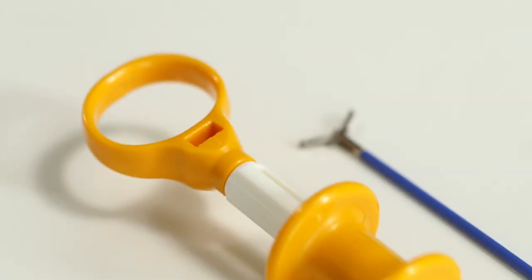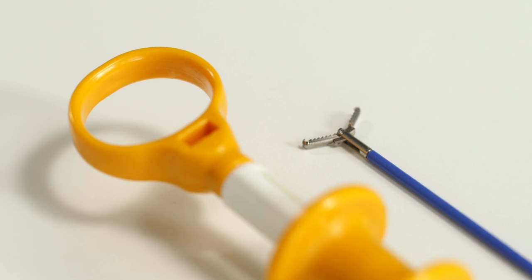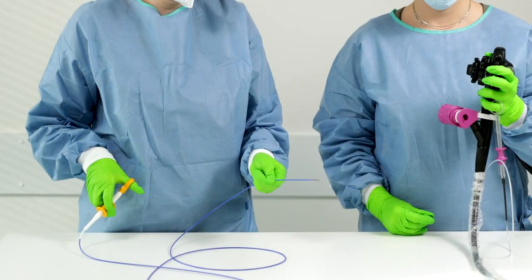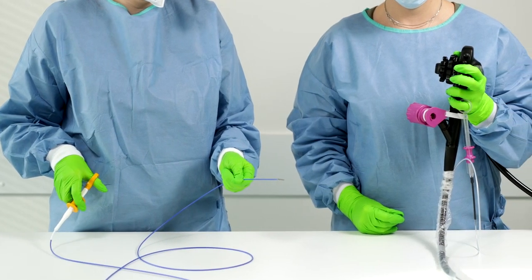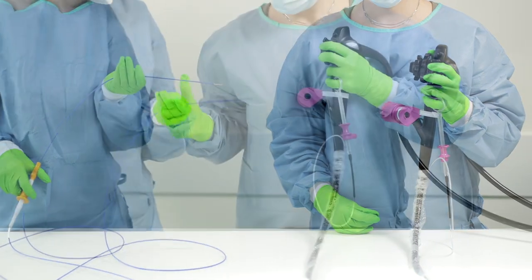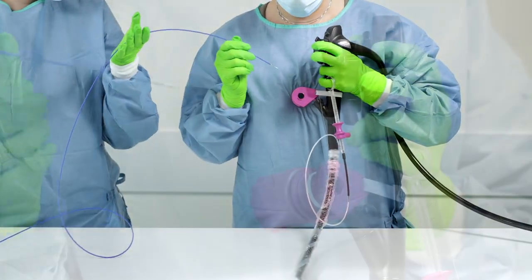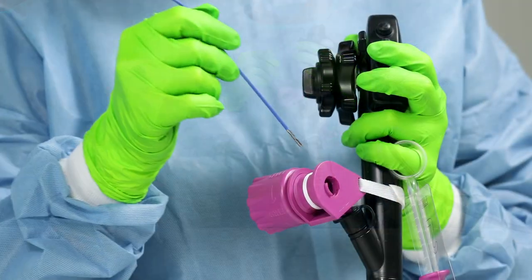While inserting the FTRD grasper into the working channel, it must be ensured that the thread remains slightly tensioned, otherwise it may wind itself around the instrument, making clip application difficult or even impossible.